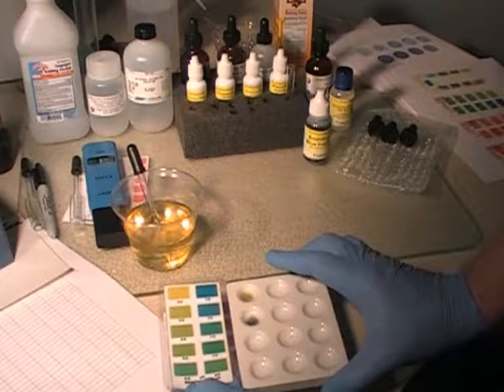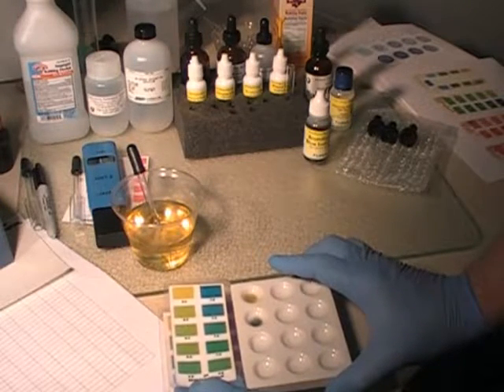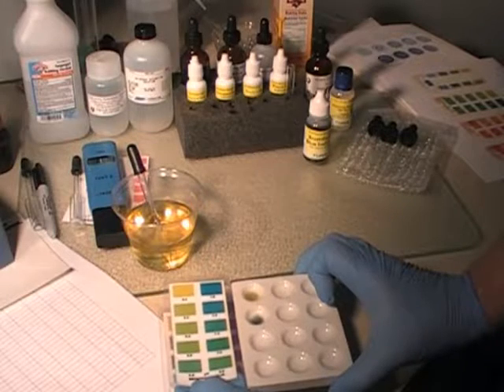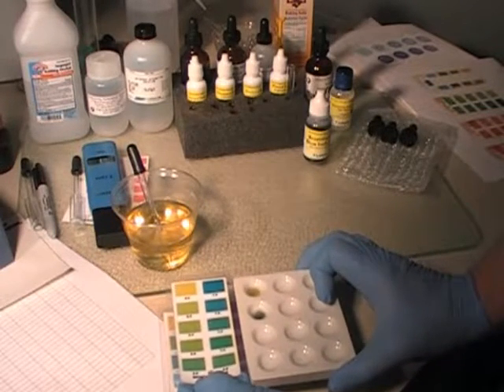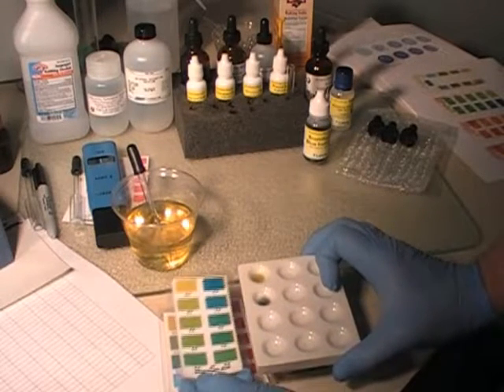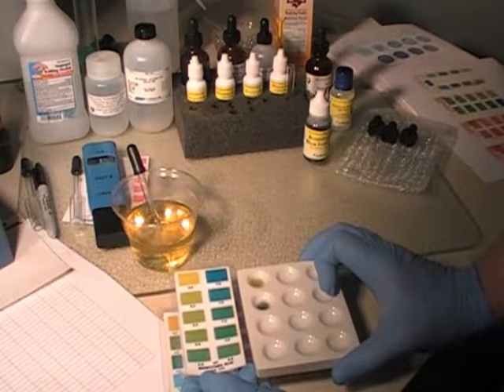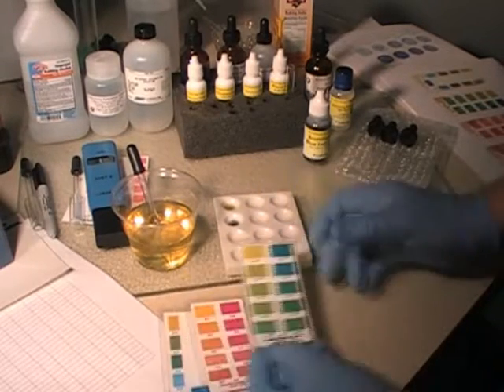What you want to do is look at both the color, the pH card and the specimen, and compare, look, and see if you can see any blue in that specimen. Can you? I see a little blue in there. So it's not just green. It does have some blue in it, but it's not completely blue. So this looks like it could be between a 7.2 and a 7.3. You could even call it a 7.2 plus if you don't want to call it a 7.3. I'm going to call it a 7.3.